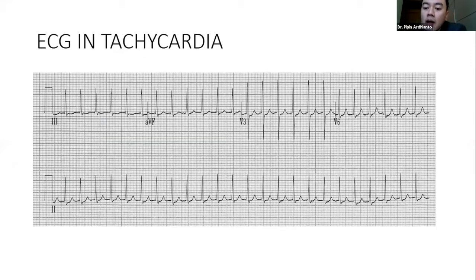That was my comment for you, Mr. Amir. It goes to Ms. Liang. I really like that during the study you emphasize the conduction properties. Because when there's AV block during a tachycardia, it will make it likely to be an AT. But if you suspect an AVNRT, then we should try to get consistent conduction. And if Wenckebach occurs super early, we know that by doing the study it's very unlikely to get any tachycardia, so then we have to think about giving isoprel and all that. So taking note of what is happening during the study is really important, and I like that you emphasize that.